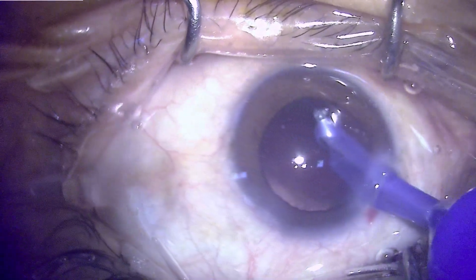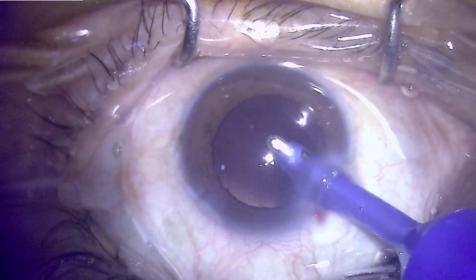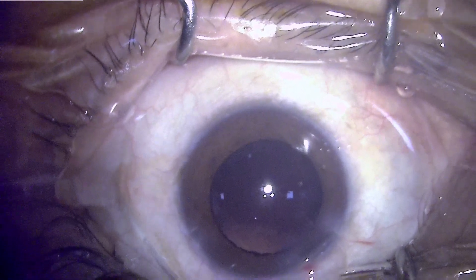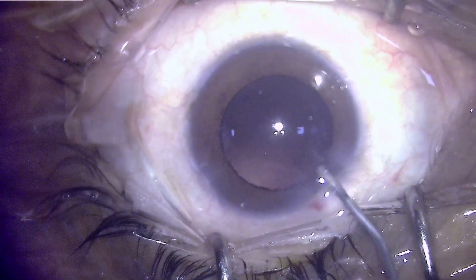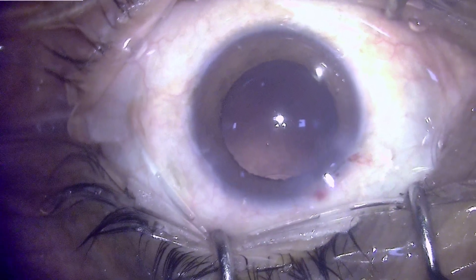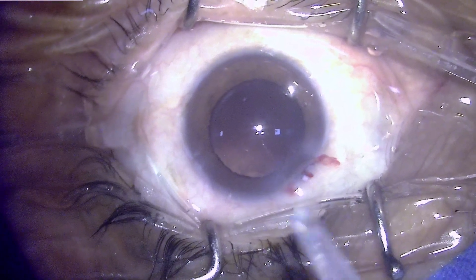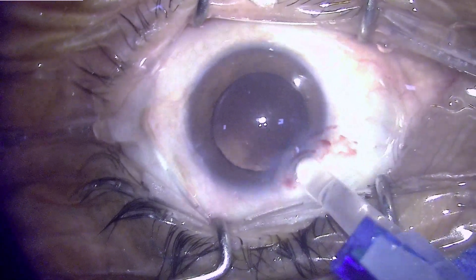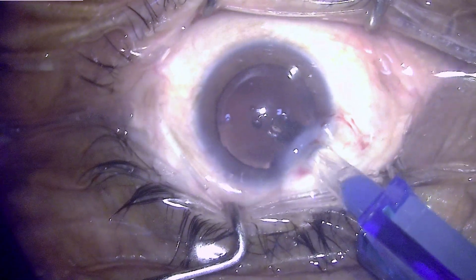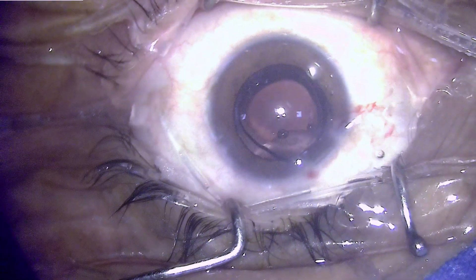This finishes the removal of lens matter and now it is time to implant the intraocular lens. I have sped up those parts of the surgery which were not relevant to nucleus removal; however, the nucleus removal was done in real-time speed. The IOL goes into the bag and the trailing haptic is simply dialed in.